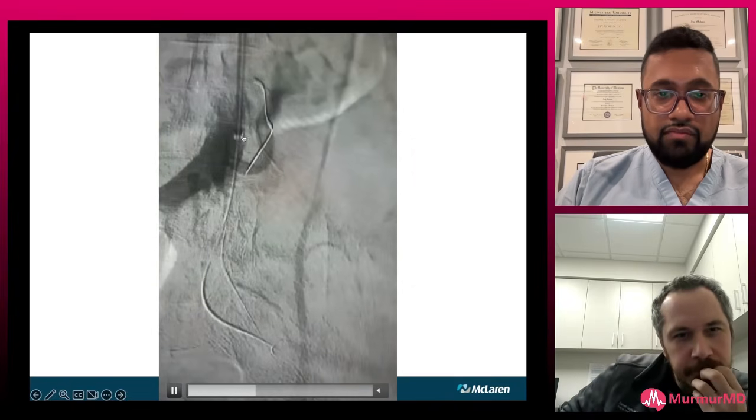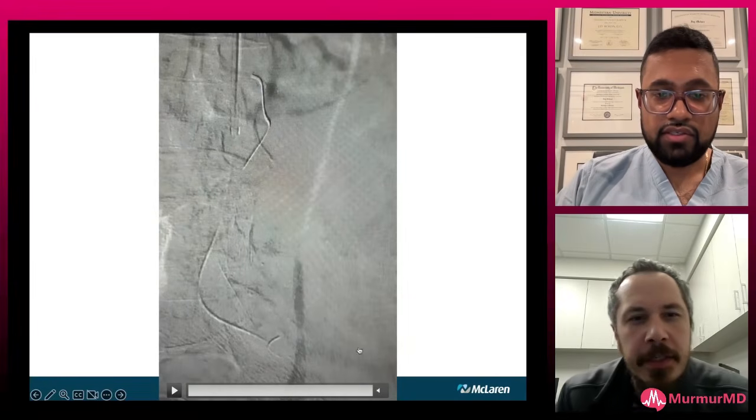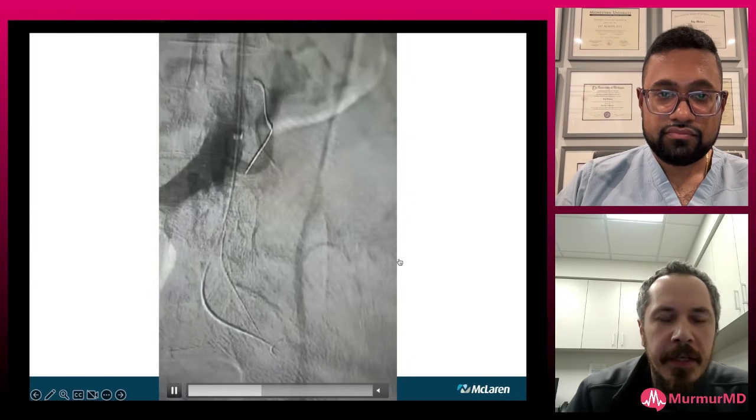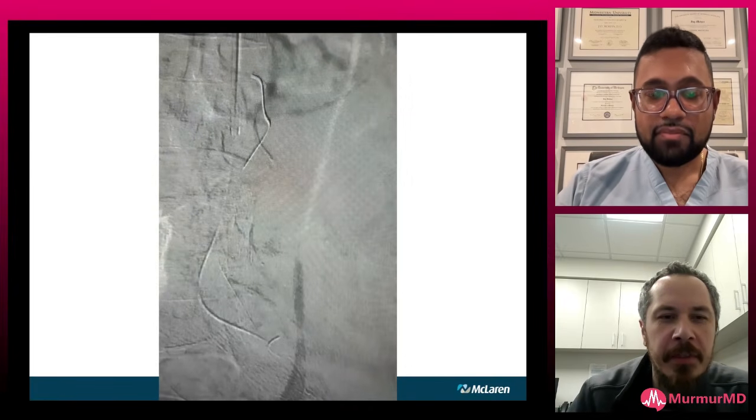And that's what we did. We were able to actually probe down, and then we were able to traverse that CTO. Wire in no man's land. I think most operators will just pull that wire. I think that other people would pull that wire, and I think that's a mistake. What you just did here is phenomenal. It helps you figure out where that nub is.